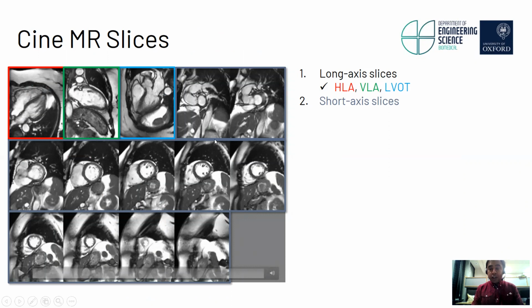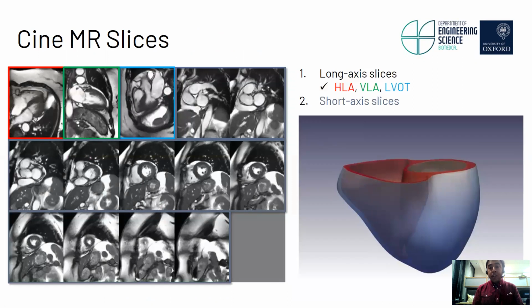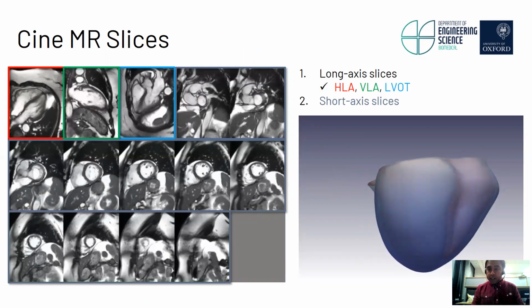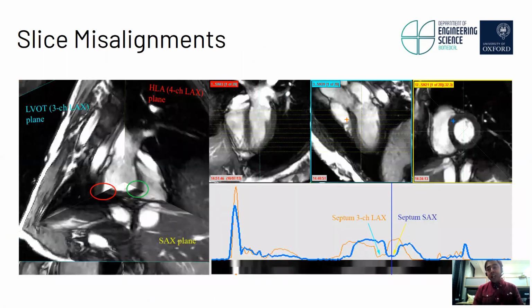Now, in different clinical applications, one of the very important problems is the automated reconstruction of both the left ventricle and the right ventricle from the cine slices. However, the biggest challenge during this reconstruction is the misalignment between the slices, because these cine slices are acquired sequentially but not simultaneously. And during the acquisition, the patients can move or breathe, or sometimes they can stop their breathing but at different time points in the respiratory cycle.